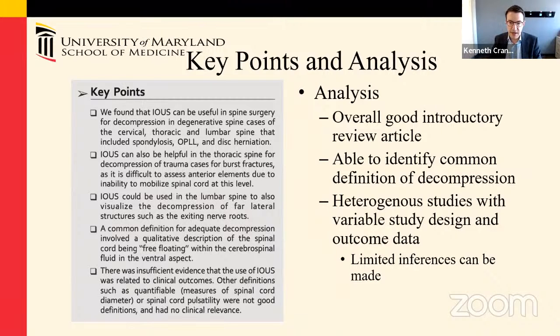But it's also not a sterile probe, so you have to use one of those sterile sheets, and you have to fill the inside of the sheath with gel, and then in all these cases you have to flood the field with saline in order to be able to transmit the ultrasound waves.